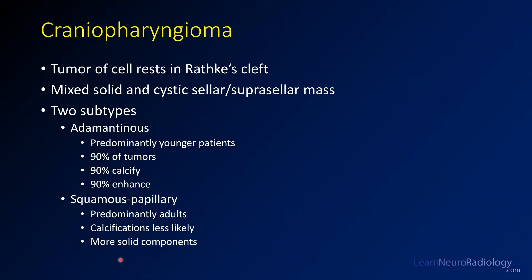This is a craniopharyngioma. These are tumors of cells that occur in Rathke's cleft. They are mixed solid and cystic neoplasms, and the most common subtypes are the adamantinomatous and the squamous papillary ones. The adamantinomatous type is predominantly in younger patients and features calcification and enhancement, while the squamous papillary type occurs in adults — this case was most likely a squamous papillary type.